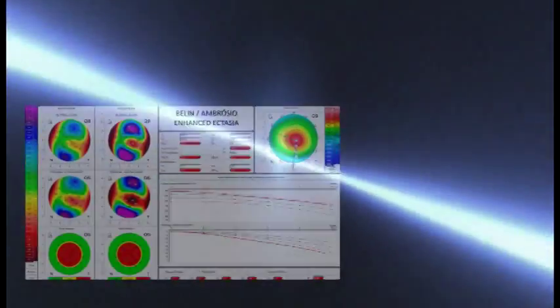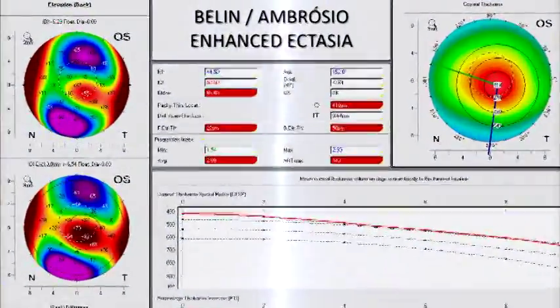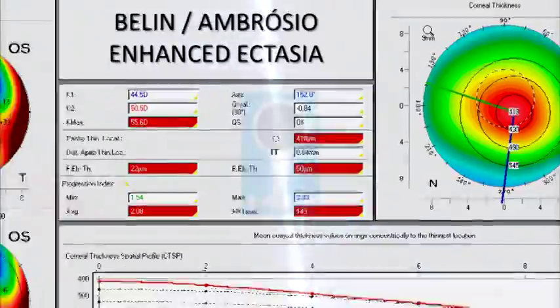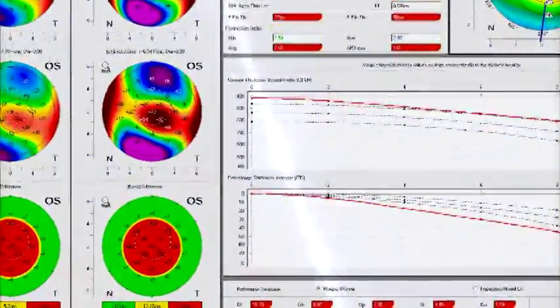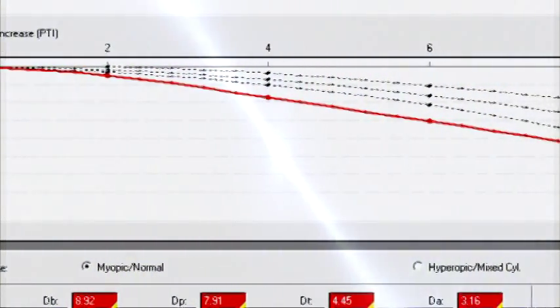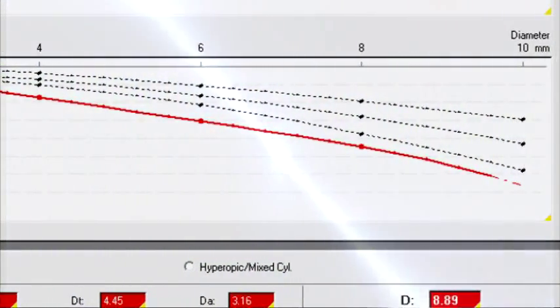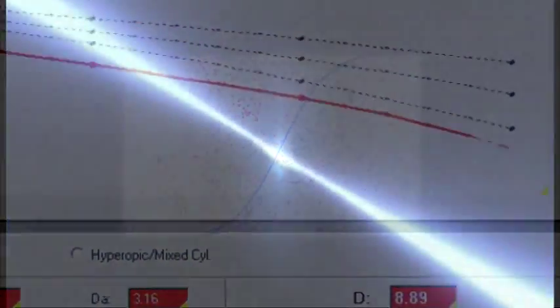The combination of corneal elevation and tomographic thickness evaluation is the basis for the Belin-Ambrosio enhanced ectasia display available on the Pentacam. The standard deviation from normality towards ectasia is calculated for multiple parameters, which are combined into the final BADD using logistic regression analysis for optimizing detection of ectasia.